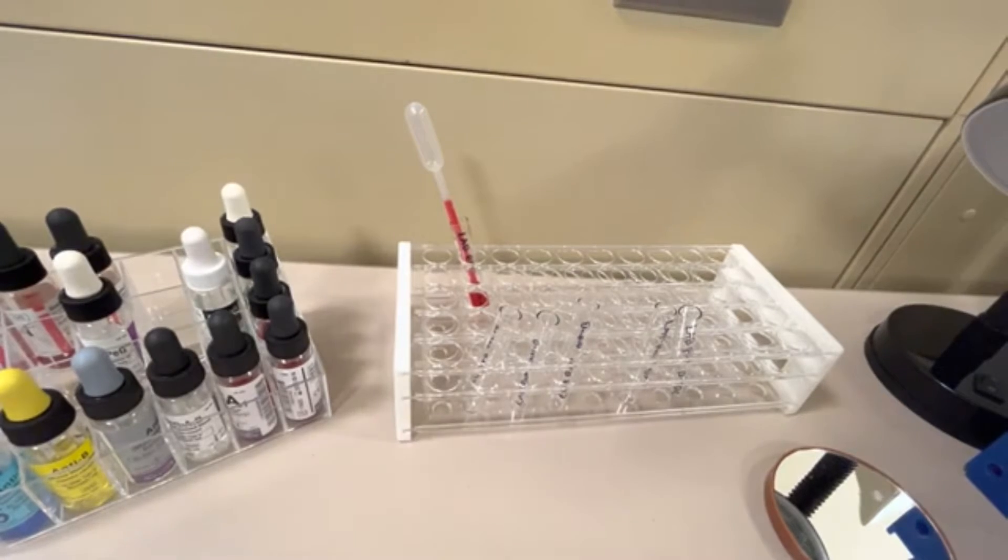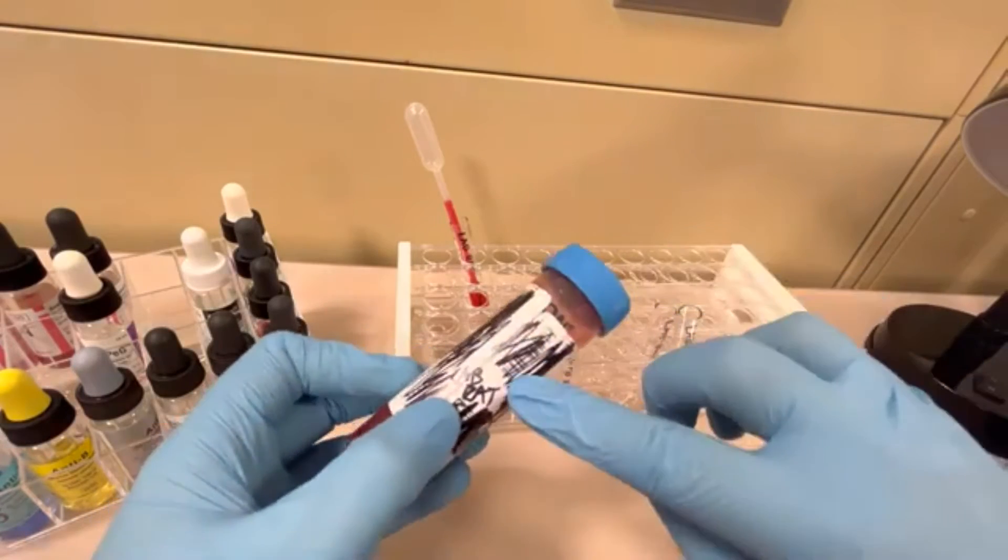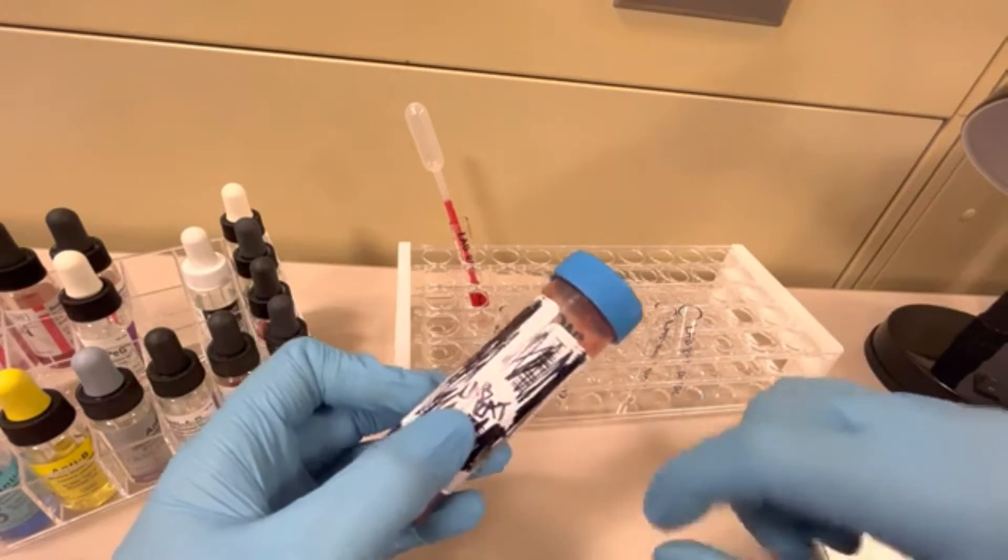In this video, I'm going to be demoing a cord blood ABRH and DAT test. The first thing we need is actually a cord blood and I do happen to have one here. It's labeled with the patient name, first and last name. For this demo, it's going to be LabRat.